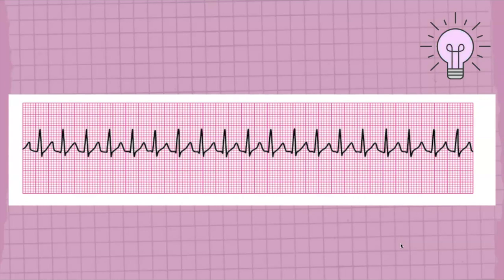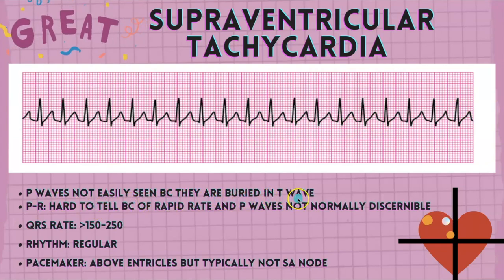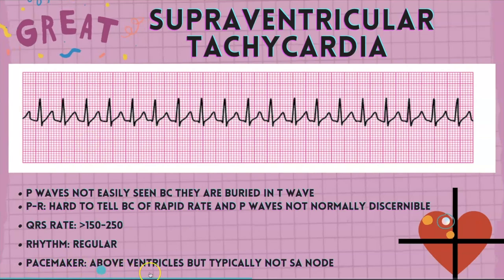Next we have this rhythm. With this rhythm, P waves are not easily seen. What's the P to R interval? It's really hard to determine because of how fast this rate is going and you can't really see the P waves. The rhythm does appear to be regular — we're looking at the R to R and it does appear regular. If you said supraventricular tachycardia, you are correct. The P waves are not easily seen because they are buried in the T wave. PR is hard to tell because of the rapid rate. The QRS rate is greater than 150 to 250, the rhythm is regular, and the pacemaker is above the ventricles but typically not the SA node.